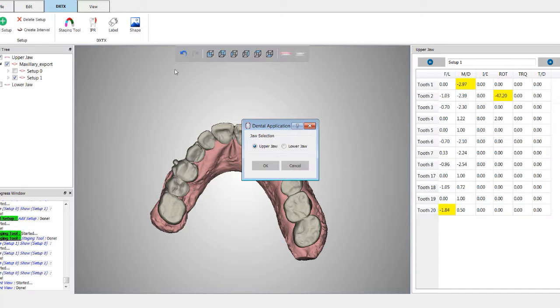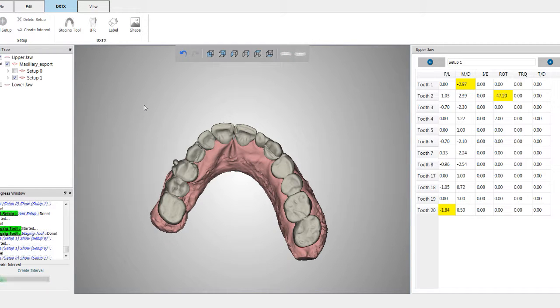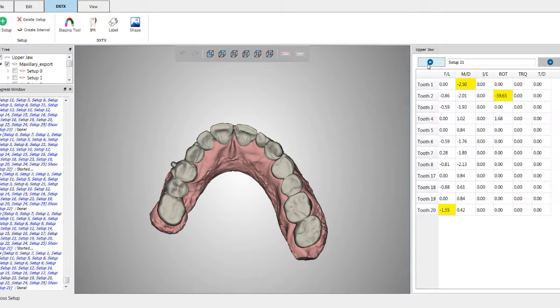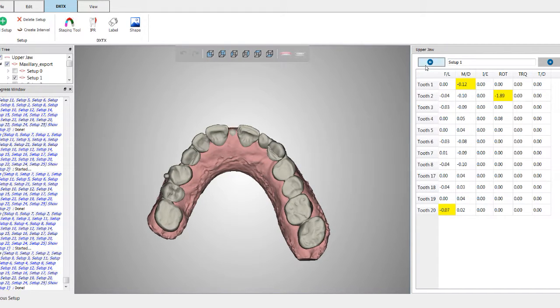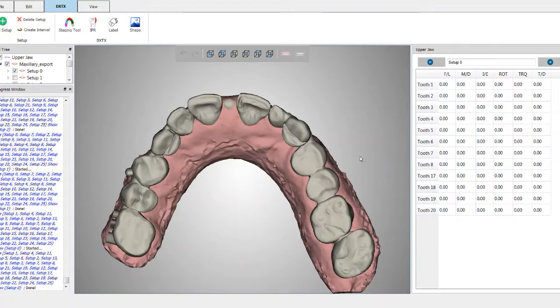Okay, so now we're going to create the intervals, upper jaw, and we are going to go ahead and create 25 intervals. Click on OK. Okay, so here we are after those 25 intervals were created, and we'll go back to 0 here, and so you can see each one of the intervals.